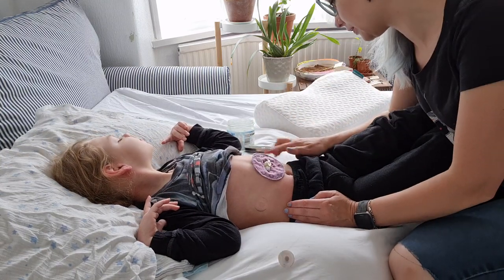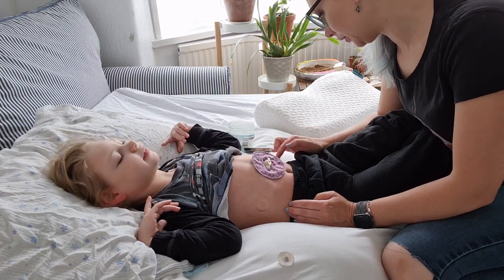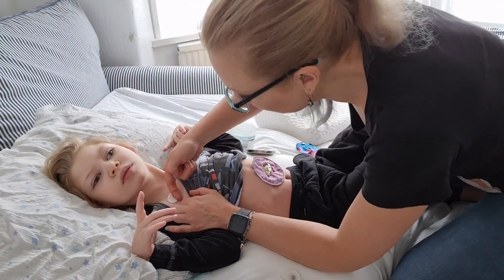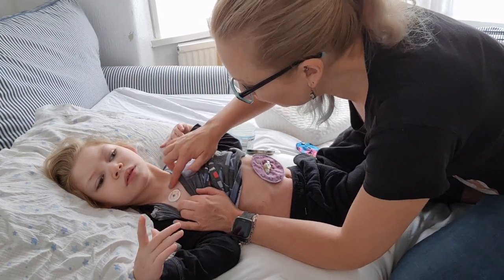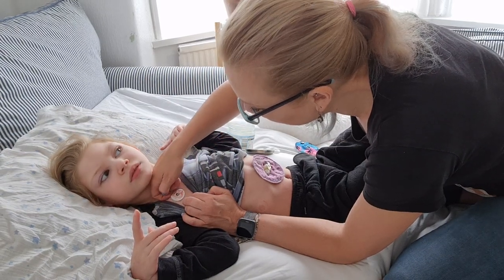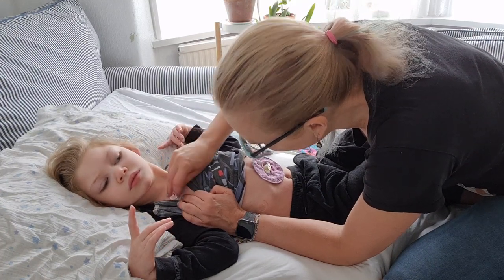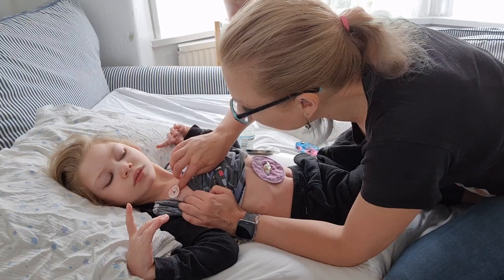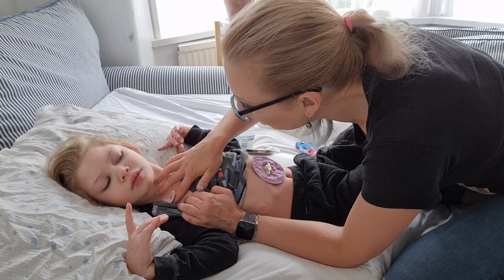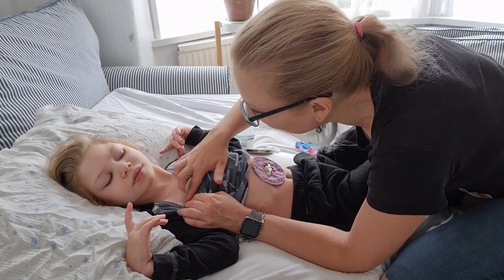There we are. I've got some stickies here as well. I think they must have moved one of them. So I'm just going to get this sticky residue off. Moving to the next one. Coconut oil. Let's see, where can I get in underneath it? There's no way in. There. Okay. How does this feel, darling? Is it all right? And the sticky's off. And we work the coconut oil in.